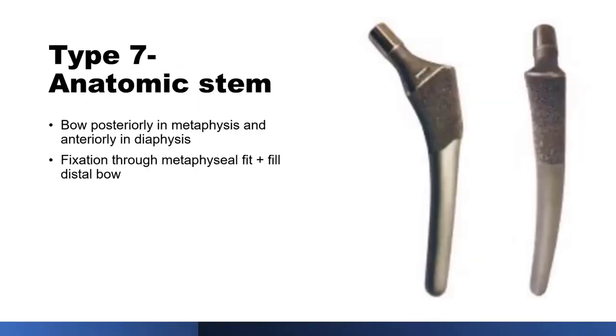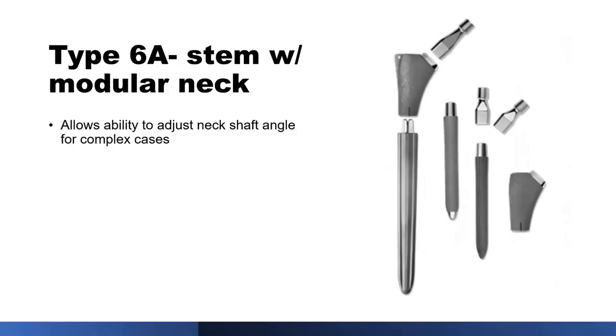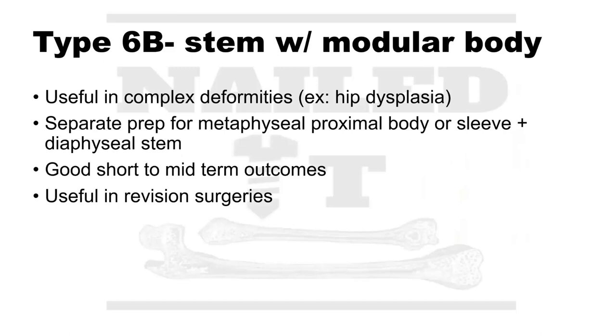I did want to clarify more, because we didn't talk about the subtypes of these 6Bs. You have the SROM we talked about, which has a neck, a proximal body, and then a distal stem. So that's three parts. You also have the 6Bs that are like your Reclaim or your Restoration modular. That's a proximal body and a distal stem, like a diaphyseal stem and a proximal body, just two parts. Those are relatively newer.